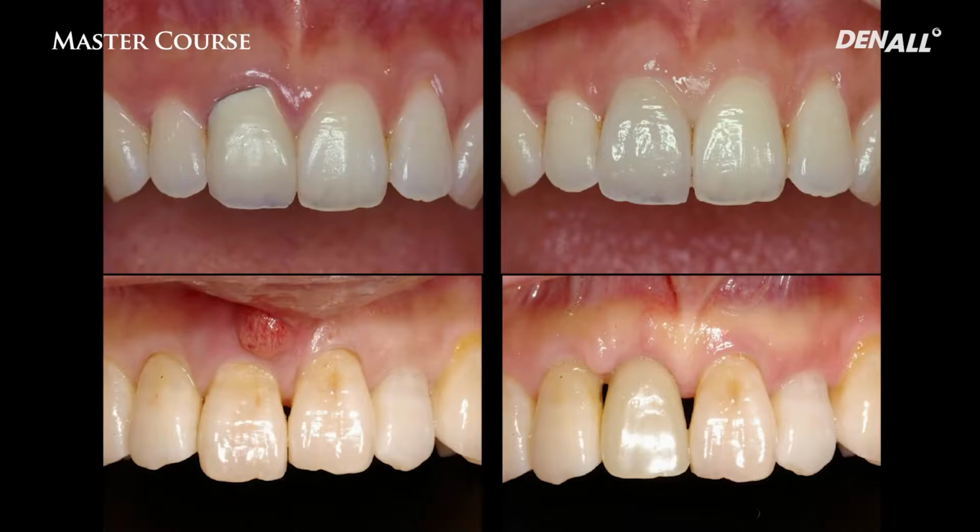If you look at below, there is a fistula. Because of that, the tooth is extracted. And if you look at the restoration of the tooth compared to pre-op, the height of the interproximal area is quite considerably reduced. Apart from it, others look okay. Harmony with the gingival line looks okay.